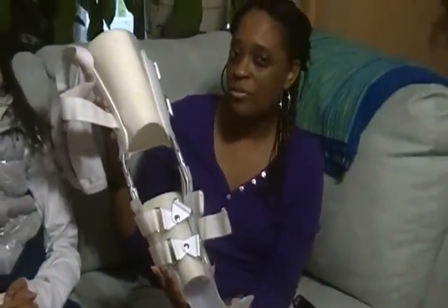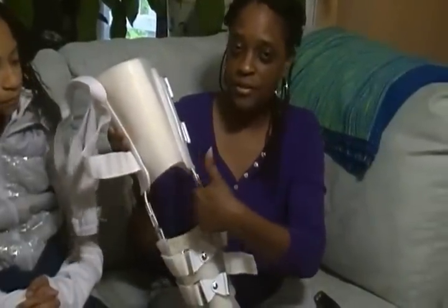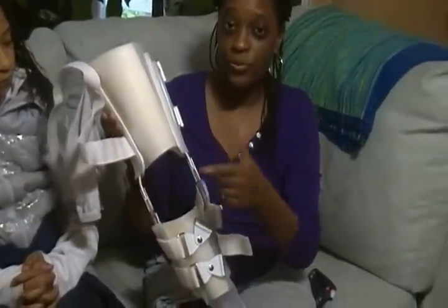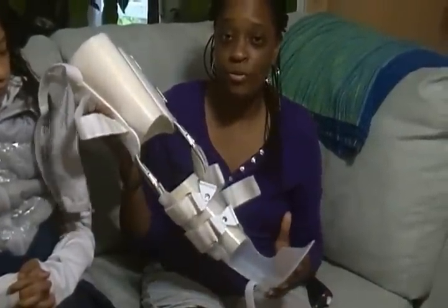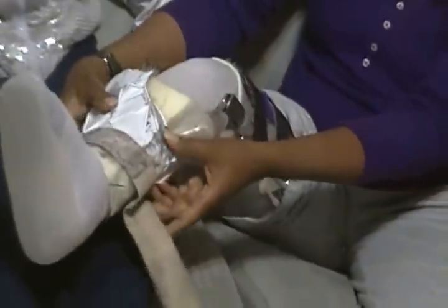because it's a little too tight and there are pressure points where my knee is — very uncomfortable. This brace has gone through ten modifications. I'm done with modifications, so I'm going to stick with the brace that's 15 years old. It's not as strong as the new brace but it works and it's what I'm comfortable with.